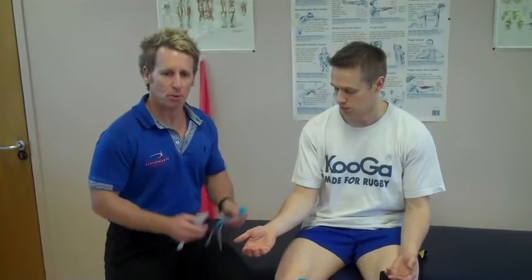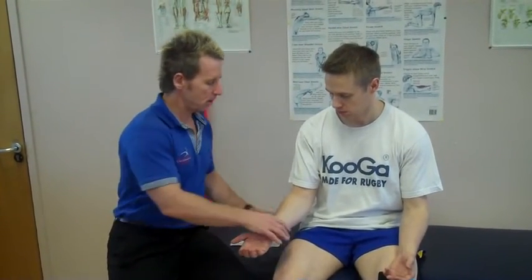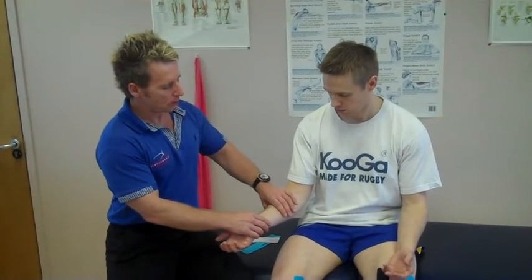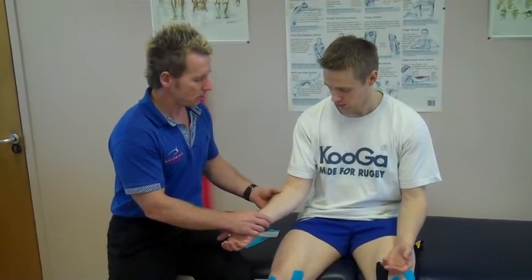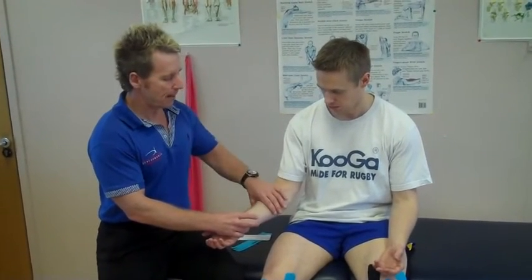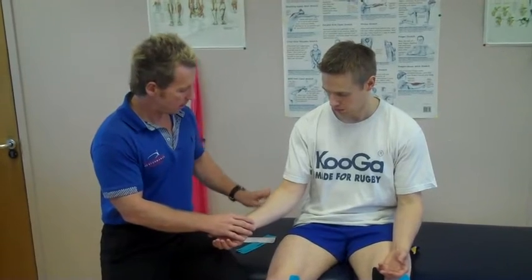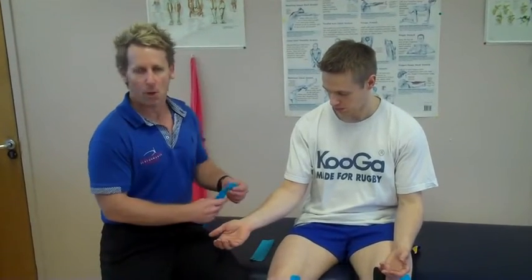Hi, my name is John Gibbons and today we're going to look at kinesiology taping using two I-strips formed into a fan. We're going to use the forearm as part of the taping, and any motorcyclists, rowers, etc. where they get pain can have this sort of muscle pumping effect. So if you've got any oedema, then this tape technique would work very well.